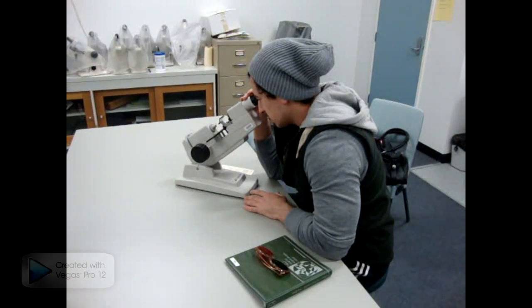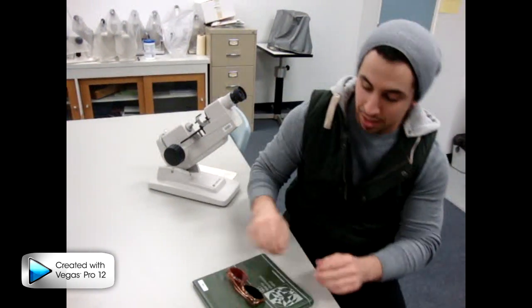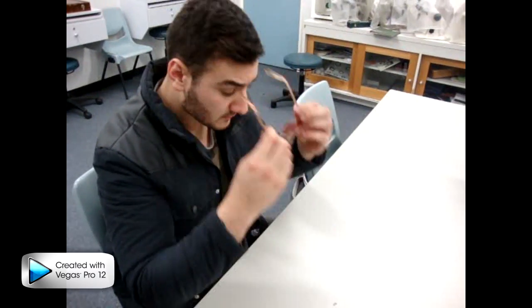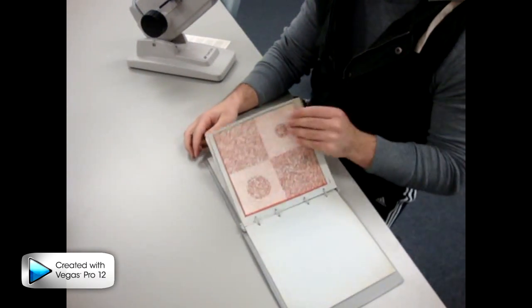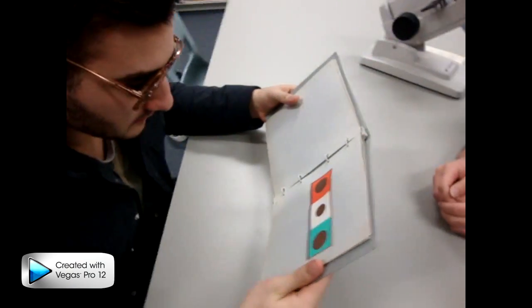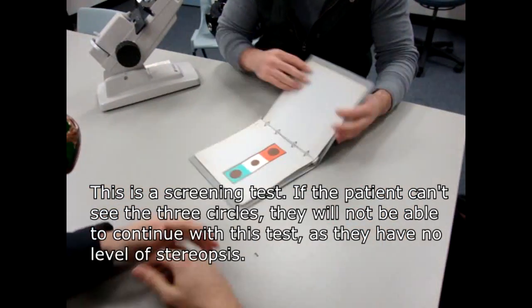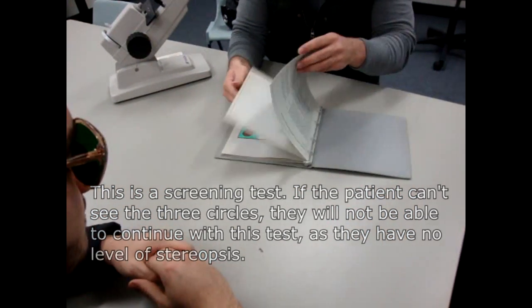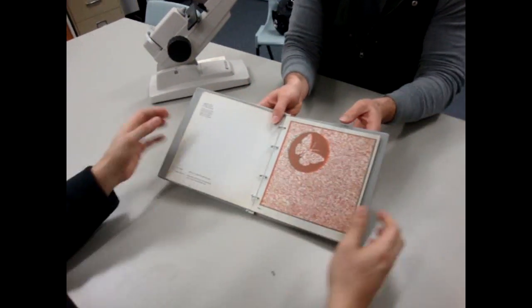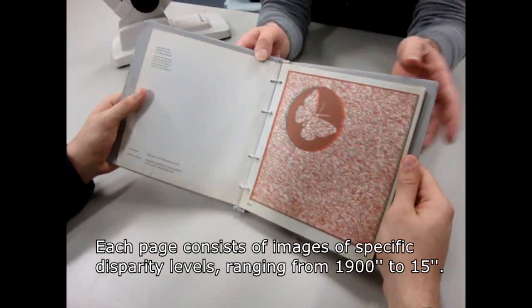We will now be performing the TNO. It tests for stereopsis. Sam, can you please wear these glasses for me? Okay. Can you hold this and please tell me how many circles you see on that page? 3 circles. 3 circles? Yep. Okay, can you please tell me how many butterflies you see? I see 2 butterflies.